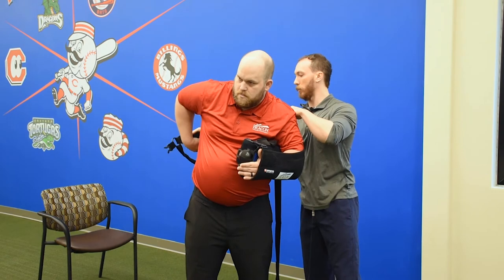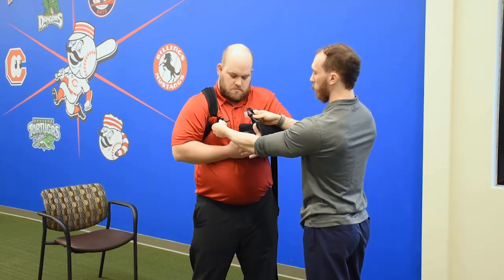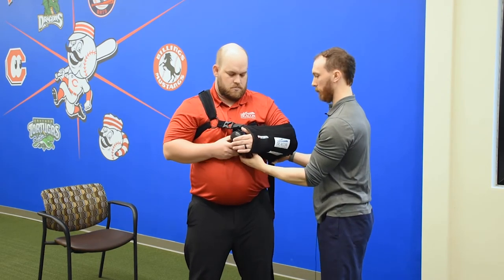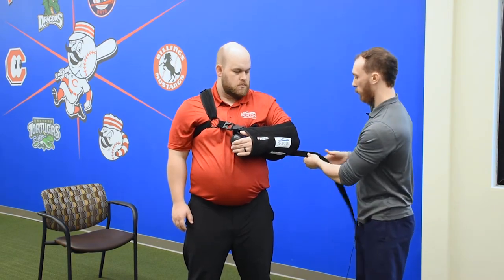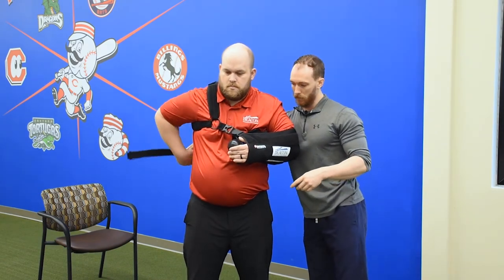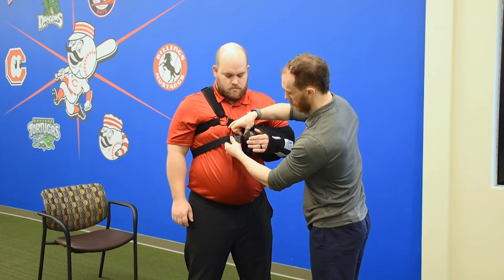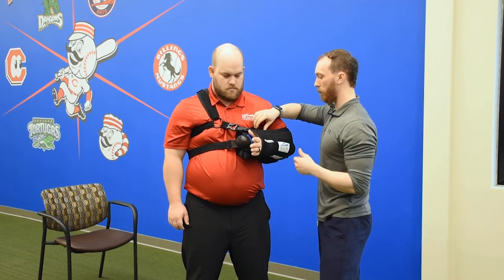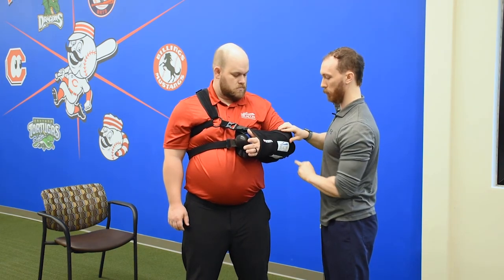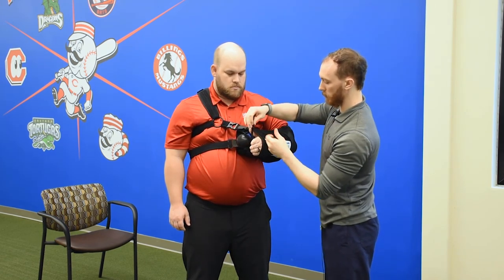We'll start by doing our strap that goes across the back — put that on just like you're putting on a jacket. Then we're going to attach our quick release here, making sure that everything's good. Then we have our waist strap that goes around the back and attaches in the front, slides into the clip and snaps in. Then we have two straps: one that goes across the forearm with Velcro, and one that goes through the webbing of the thumb that attaches onto the canvas as well.